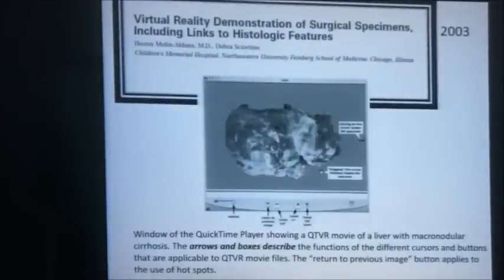How did virtual microscopy start? Like, in the past. See, this is an old paper here. This is to show you how things started. There's just an image and some annotation on the image. You can see annotation here. This is a gross or macroscopic examination of the specimen, and it's just marked with these, so there's no need for anyone to teach you anything, because you can just have a look at the image and see the annotation, so you learn by yourself.